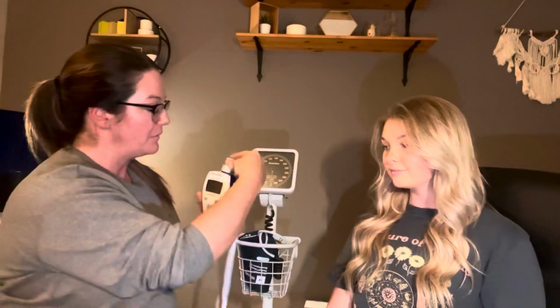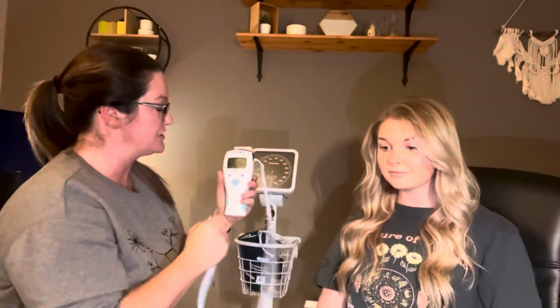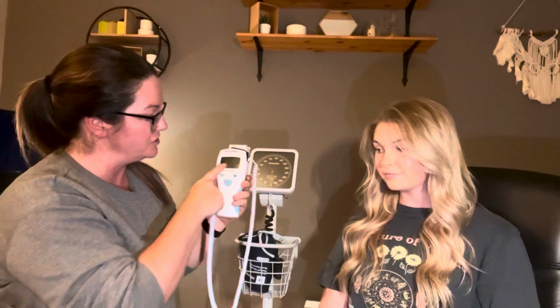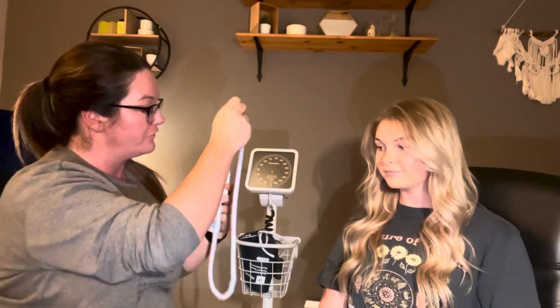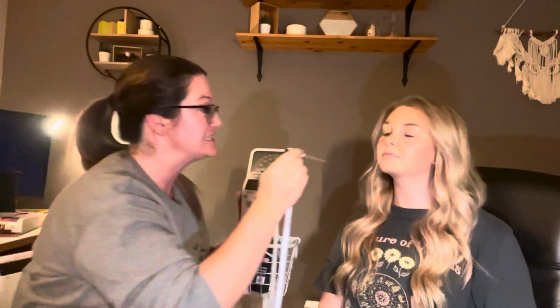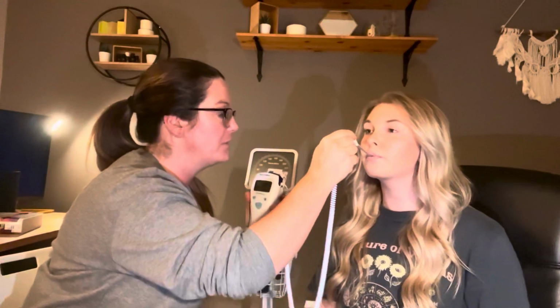So first thing I'm gonna do is start with a temperature. So when I remove the probe from the machine, it's going to turn on. The little blinking head is gonna be for an oral temperature, which is what I'm going for, and I'm gonna push the button to make sure that I'm in the correct mode for degrees Celsius. I'm gonna place a probe cover on. Can I get you to place this under your tongue and close your lips around the probe?